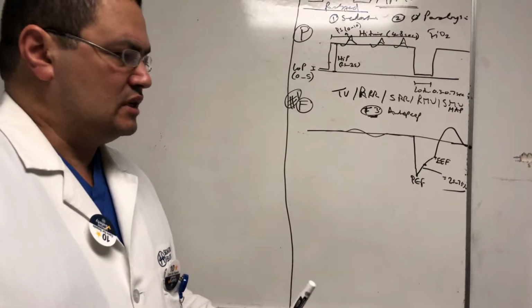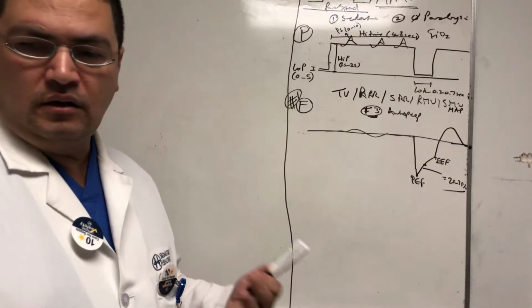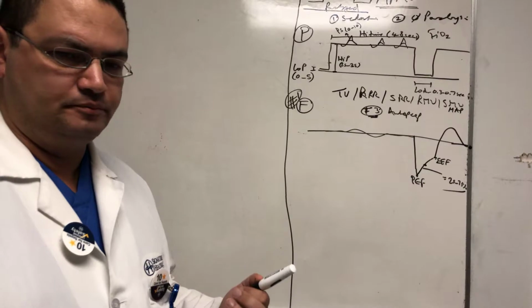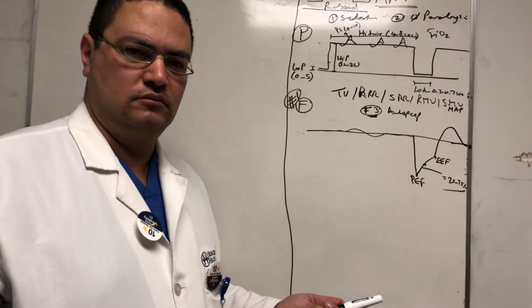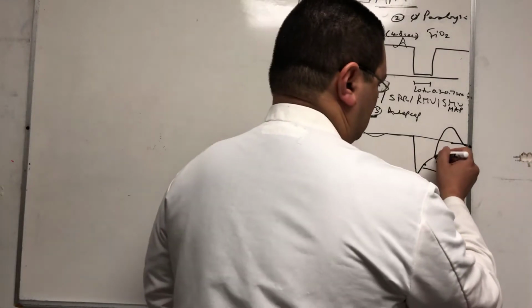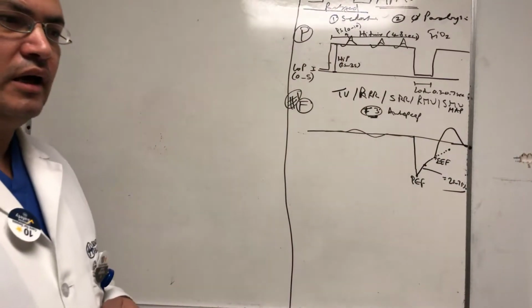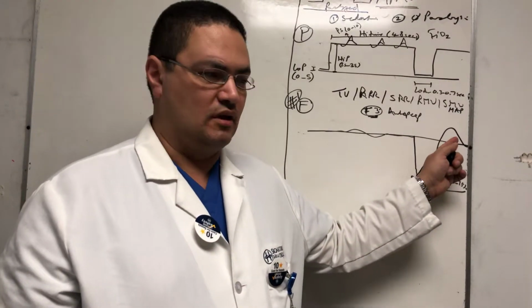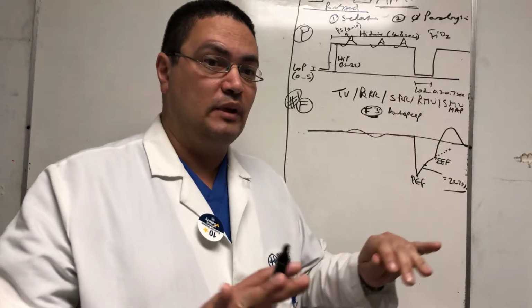How about if the ratio came out to be 10%? Professor Lyon, 10%, what does that mean? It means that you're giving them way too much time to exhale, right? Exactly. So you shorten the low time. That means this reached here, close to the baseline. And imagine if this waveform reached actually to the baseline, to 0 on the floor. That means that you exhaled completely.